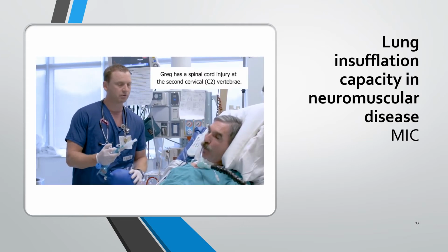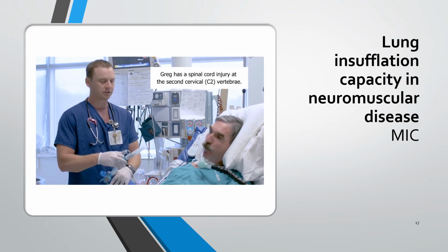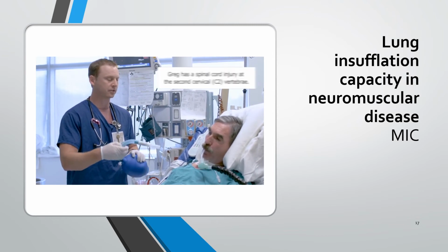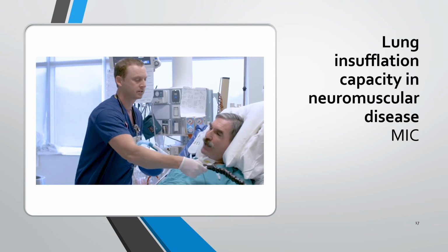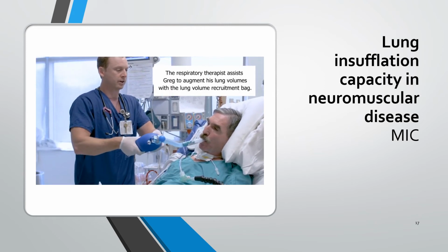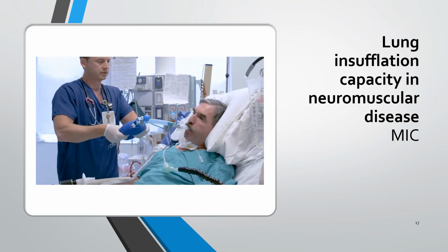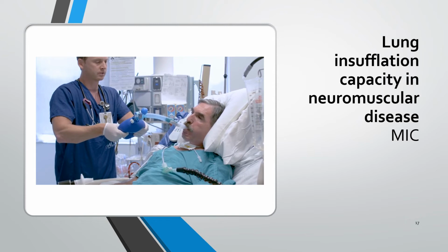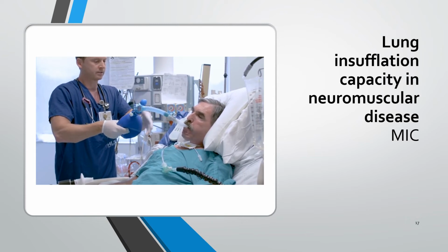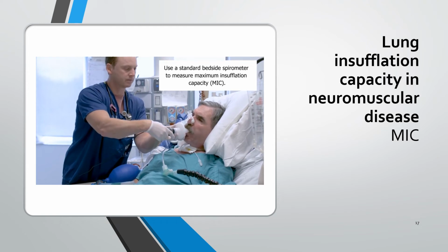Okay, Greg, we're going to do breath stacking now with the manual bag, okay? So I'm going to place this in your mouth and we're going to give you 5 big breaths, okay? So I'm going to remove this. Okay, yep. Breath 1, breath 2, breath 3, breath 4, breath 5, and breathe out.